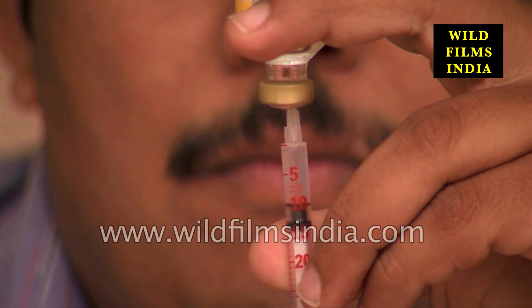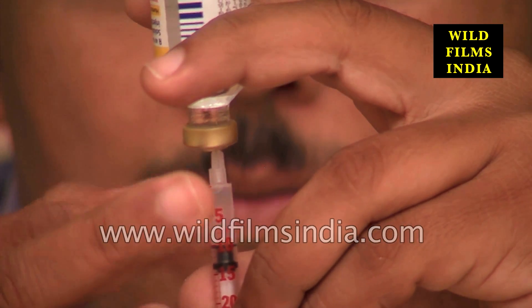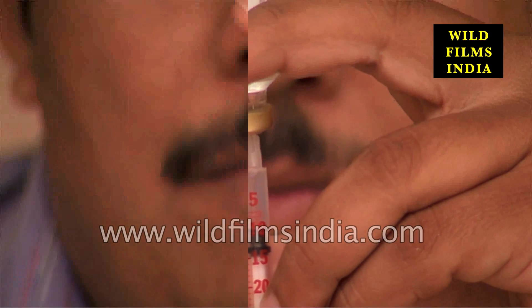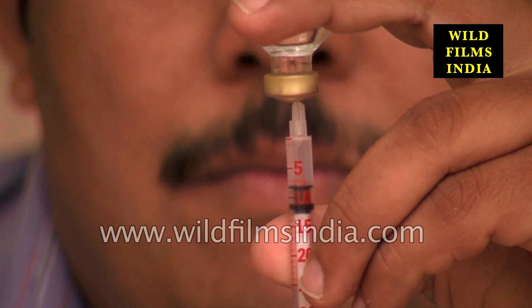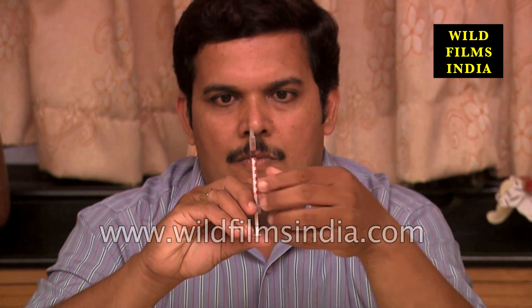If air bubbles appear in the syringe, gently tap the syringe with your finger to make the bubbles rise to the top of the syringe and push the insulin back into the vial. Draw back the plunger a second time to get the desired dose. Pull the syringe out of the insulin vial and double-check the dosage.